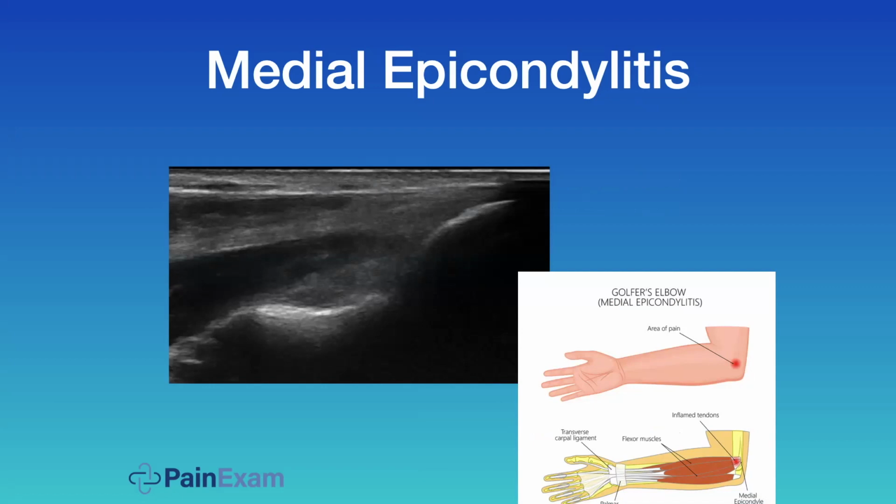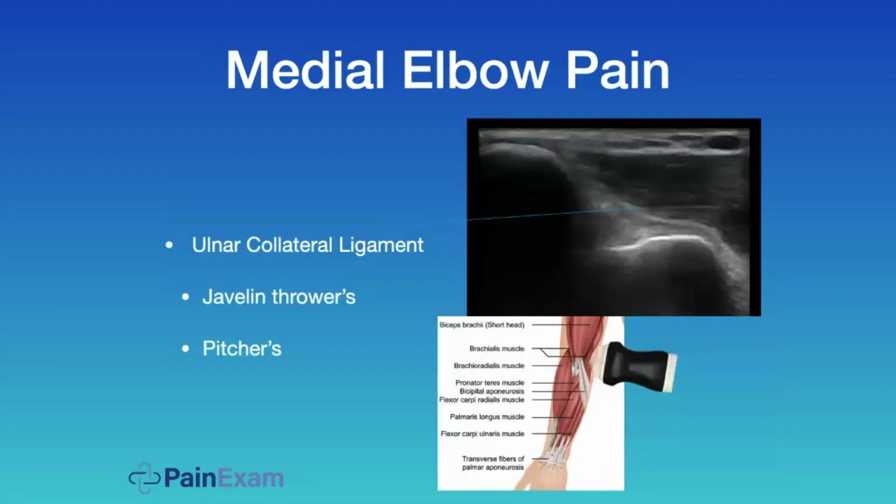Here's a picture of where the pathology is, and here's the tendon inserting on the medial epicondyle. When doing these injections, I'll typically have the patient have their elbow flexed and put the ultrasound here. Sometimes the ultrasound gets in your way, and you need to get posterior to the probe to do an in-plane injection, and be quite careful not to inject in the tendon. If it's resistant, do not inject. Also, you have the ulnar nerve nearby, so you want to be really careful.